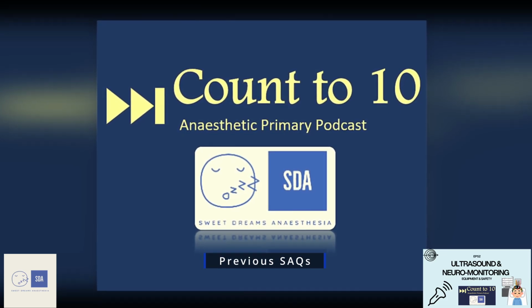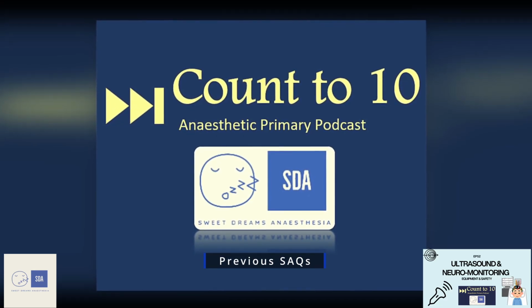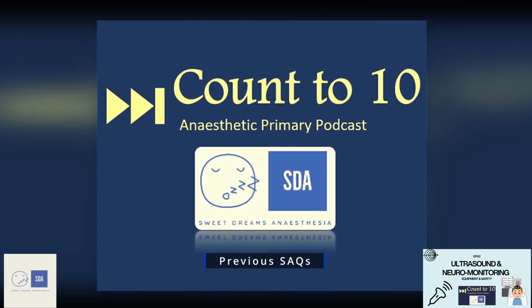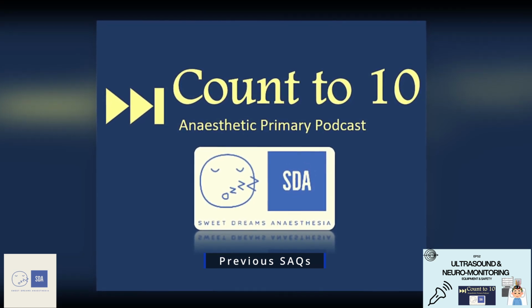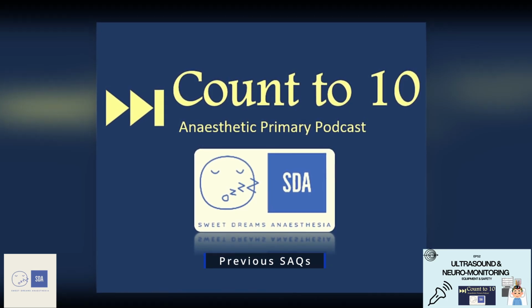To finish off this question, you could then talk about the possible disadvantages and advantages of measuring cardiac output in this format. And the biggest disadvantage would be that it requires a special probe. So classically, your phased array echo probe. It requires training to do, so it's operator dependent. It takes on some assumptions based on what your incident angle is of your Doppler.